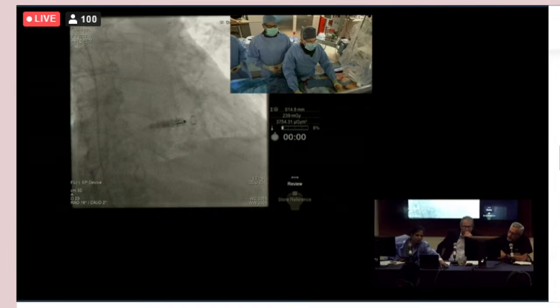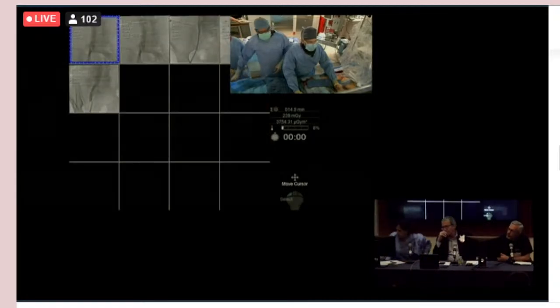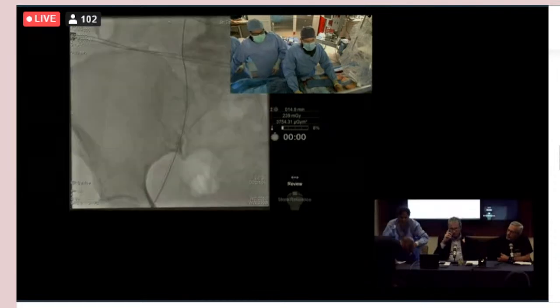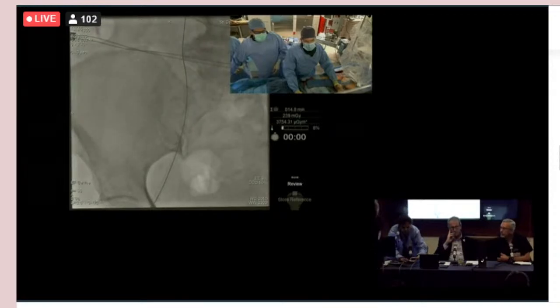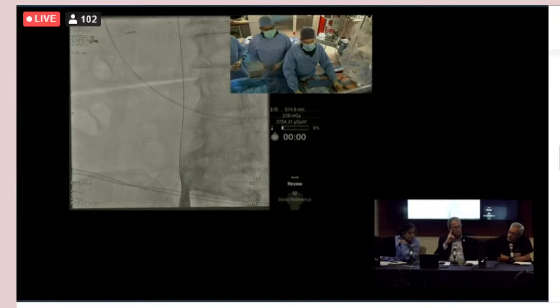All right, guys. What happened? It looks like the wire had some difficulty, but now we're back up. Is that correct? So what happened was, I'll show you some video here. This is all from the left subclavian vein. It kind of looks like we extravasated, but we didn't, fortunately. We tried and could not pass that stricture point right there where the L is. So there's some narrowing in the vein.